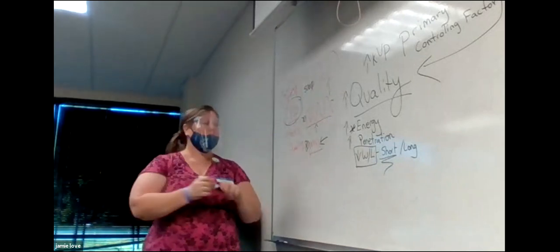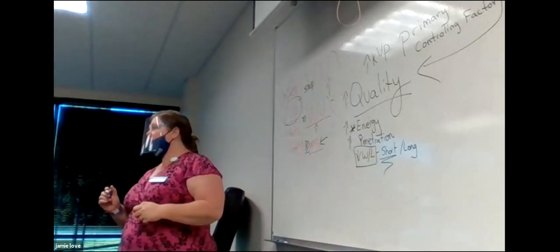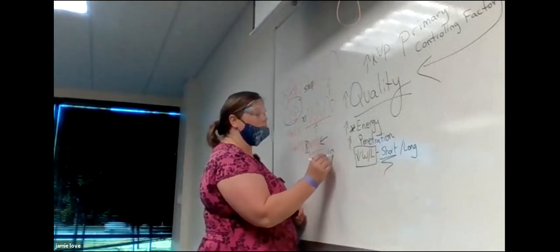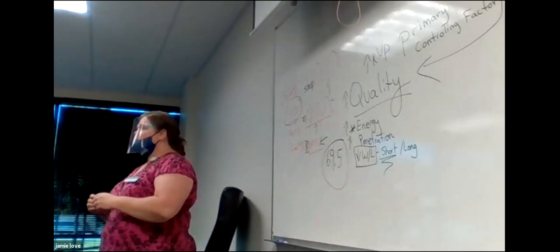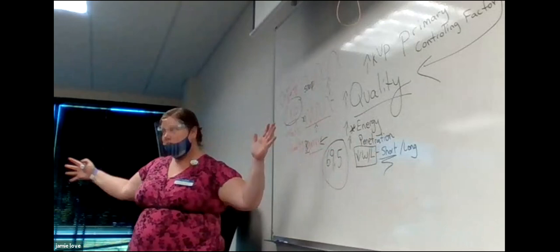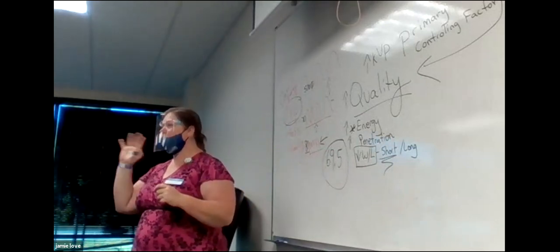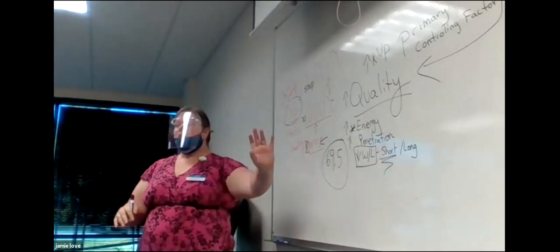One third of the energy is the average energy of the brems X-rays. Characteristic X-ray energy is always 69.5. That's the energy lost. So brems are the range of X-ray energies. Characteristics are always going to peak at that 69.5, and we're going to look at that on the spectrum in a minute. So we know what quality and quantity are.